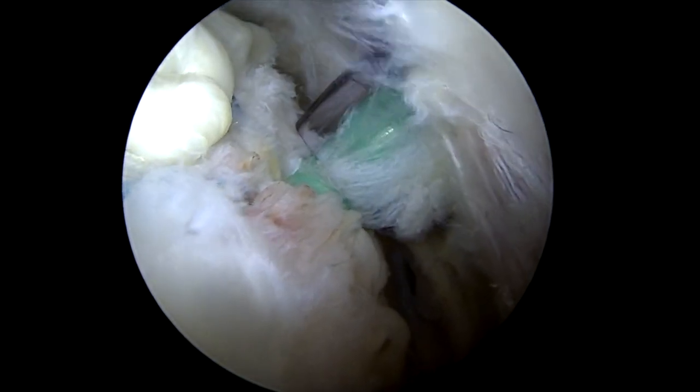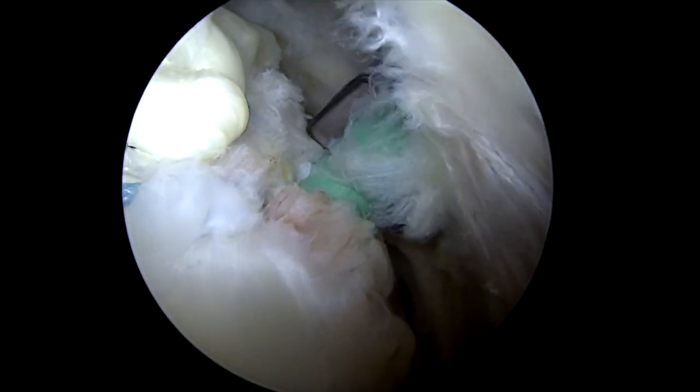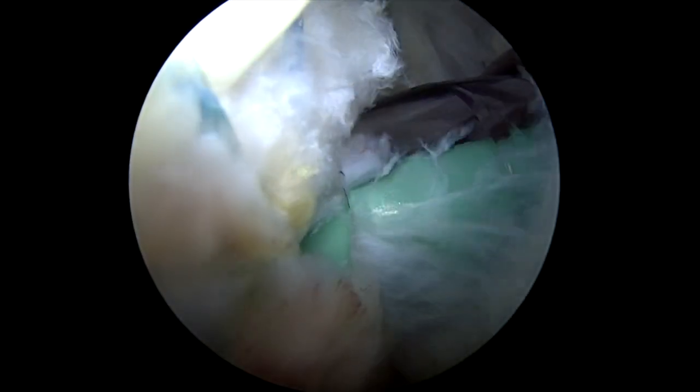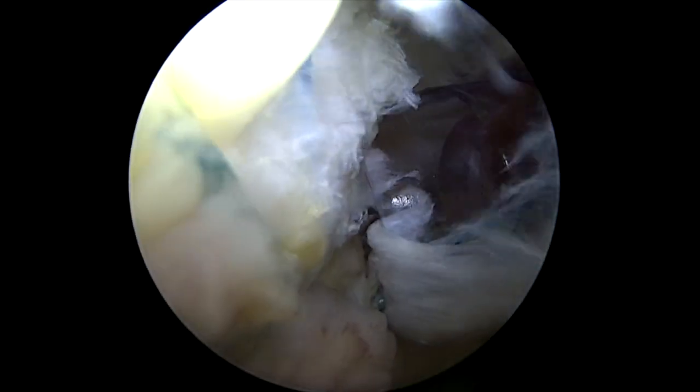I'll also often look on the articular side. This can be a double-check to make sure you've brought the tendon all the way to the articular portion. You can see here the anchor's not quite in there far enough — I'll put it in a little bit more. I always double-check this. You don't want your anchor to be sticking out at all, as that can cause subacromial impingement symptoms. Cut our sutures here again, and then we're done.